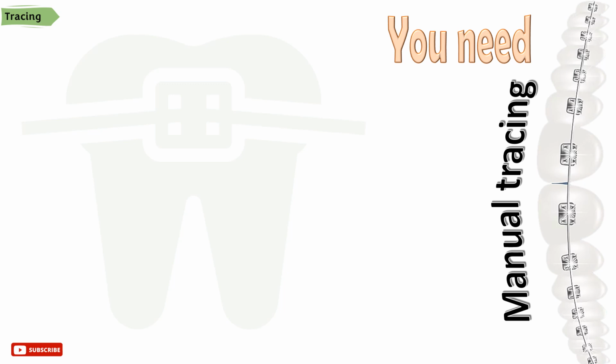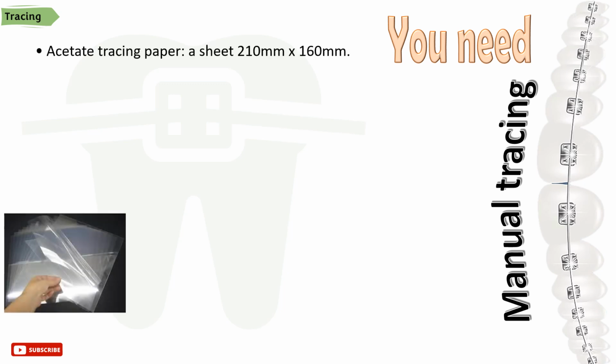For the manual tracing of the cephalometric film, you will need the following. Acetate tracing paper, which is the transparent paper that allows you to see the structures of the film underneath and to trace the outline of them. The sheet size corresponds with the film size, which is 210 mm by 160 mm. A viewing box, which is the light source. It allows you to see the structures in the film and to trace them easily.